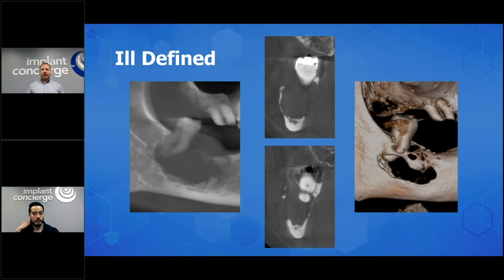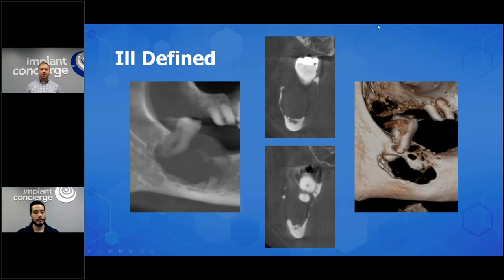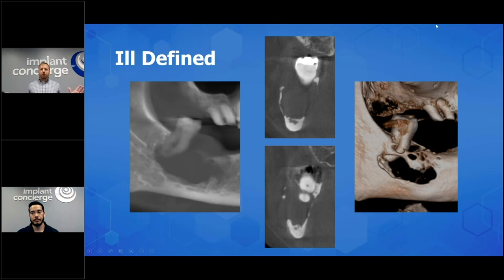That's the number one cue. There are other lesions that might look like that, but the second one makes it a slam dunk — and you can barely see it on the sagittal view — soft tissue reaction. The malignancy is just destroying everything in its path. Submissions: squamous cell carcinoma, osteosarcoma, sarcoma. That's amazing — we're thinking malignancy. Those are different differentials but you know, just because of those findings, all of those are worth considering in a report.